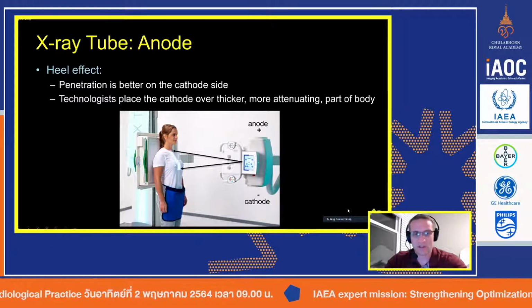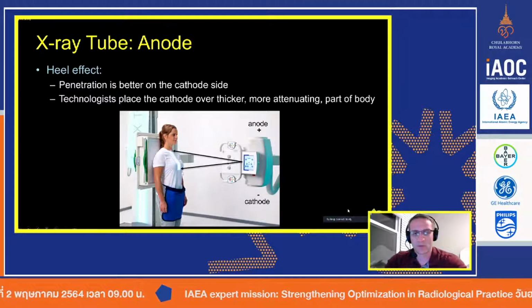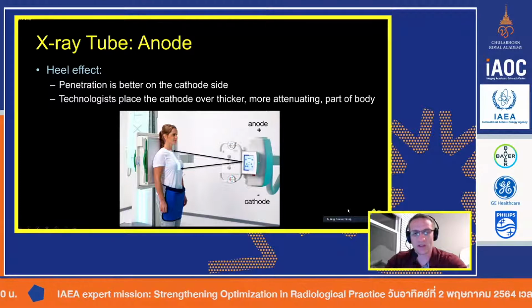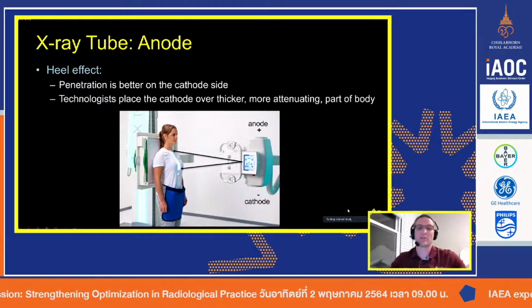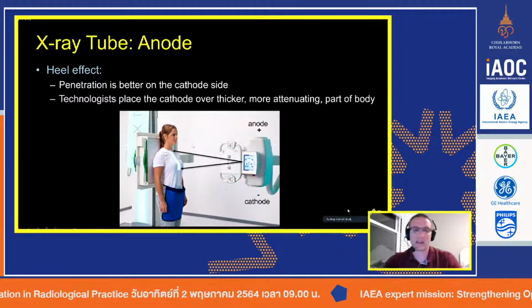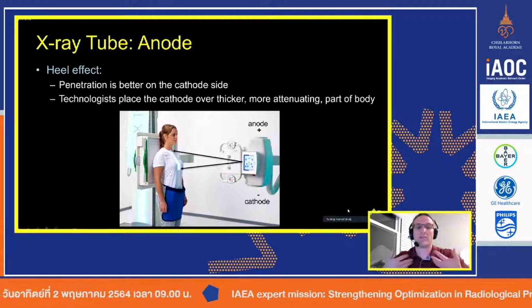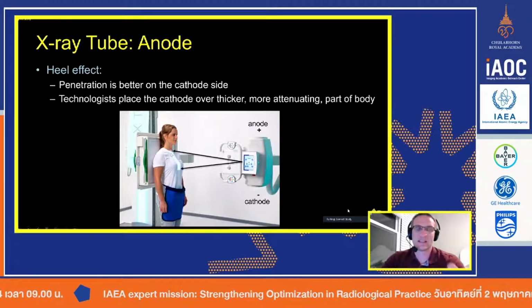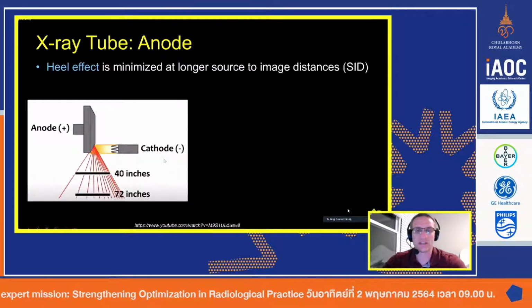It's not necessarily because they're thinking resolution, although they may be doing that. It's because we want the beam with the most photons, the most ability to penetrate, through the thickest part of the anatomy. So for a chest X-ray, of course, that's going to be the mediastinum here. We've got our heart, we've got the mediastinum, and in the case of a female, more breast tissue that's more inferior than up here, superior, where the beam is less intense, but there's less anatomy. So we can use these techniques.